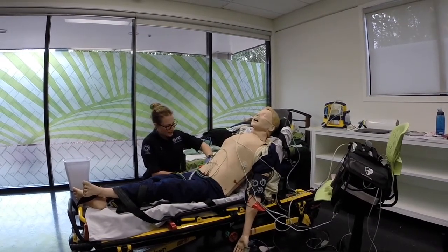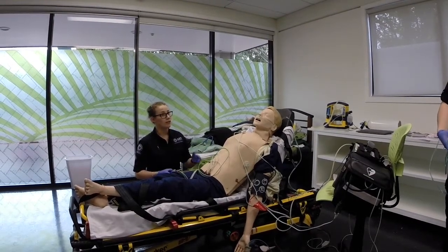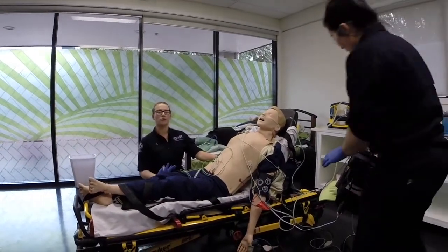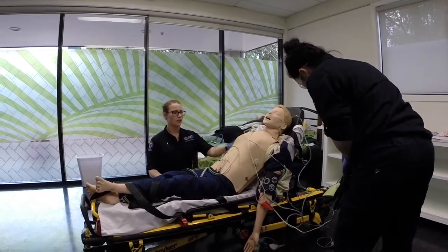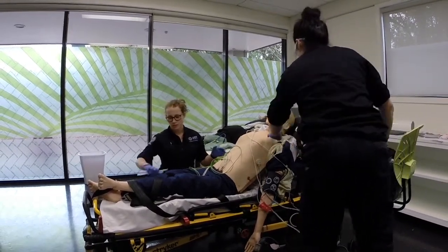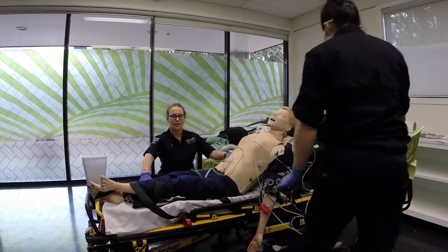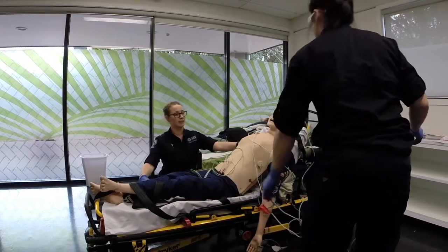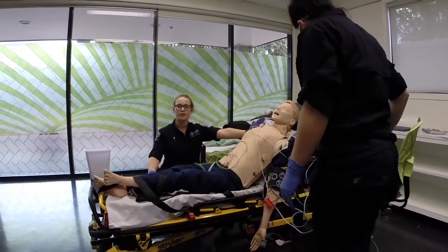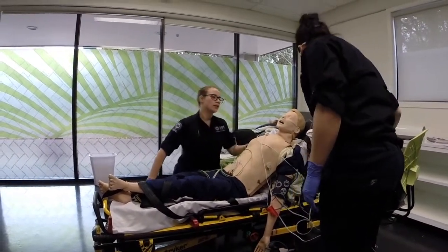So to reassess ABCs, if I can please get another full set of vitals. His airway is patent. He is still talking to me. His work of breathing is still increased. He does still have those crackles, as well as the SpO2 does seem to have increased when I look at the monitor due to the supplementary oxygen through the nasal prongs. Blood pressure is still the same, 70 on 40.